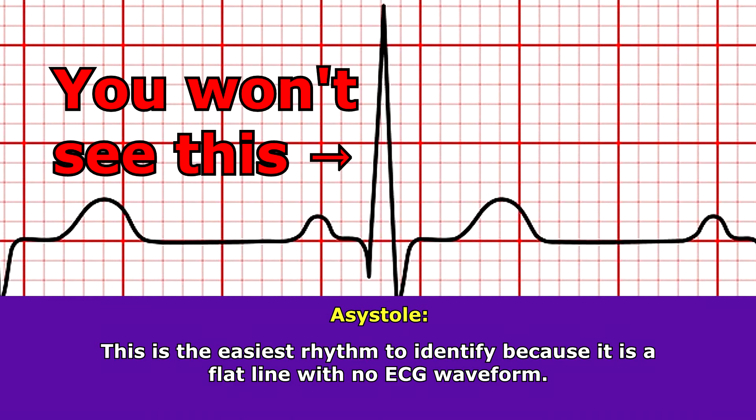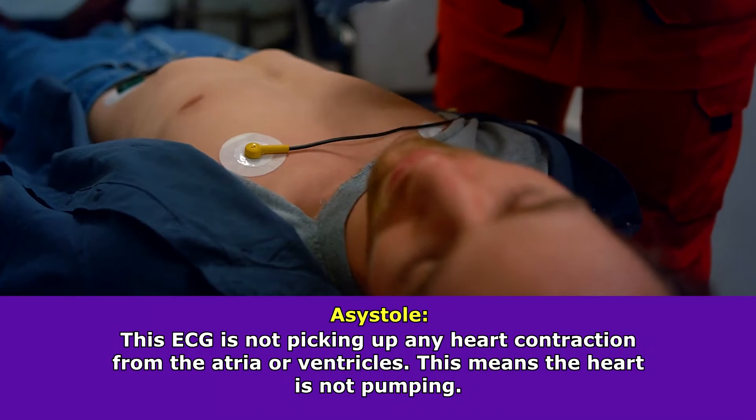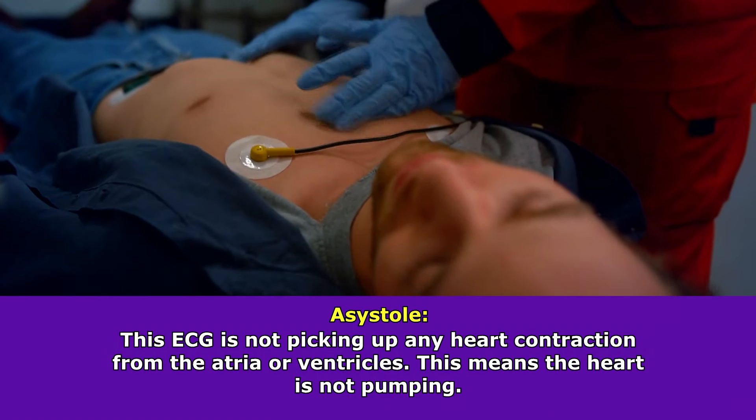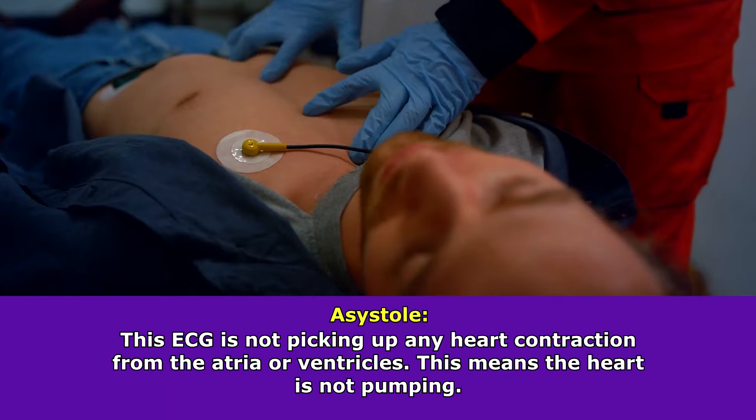The ECG electrodes are not picking up any heart contraction from the atria or the ventricle. So that tells you that this heart is not pumping.